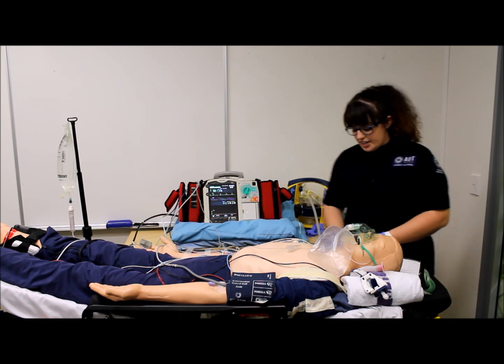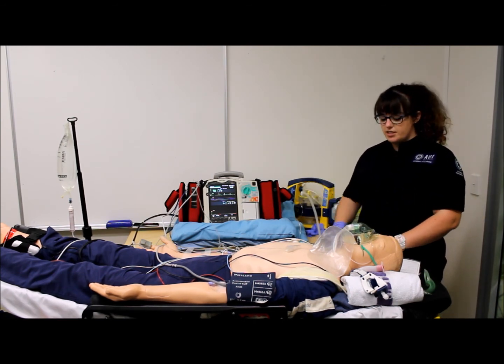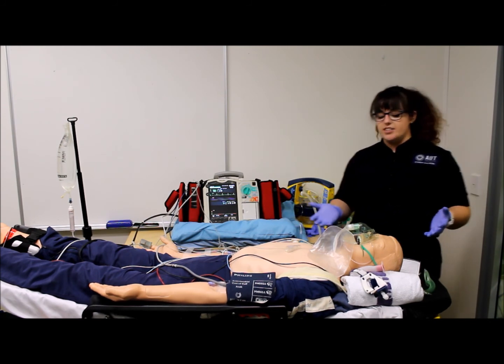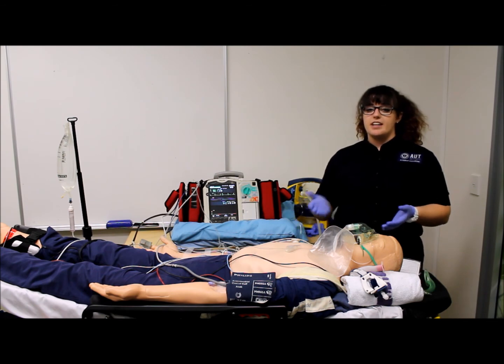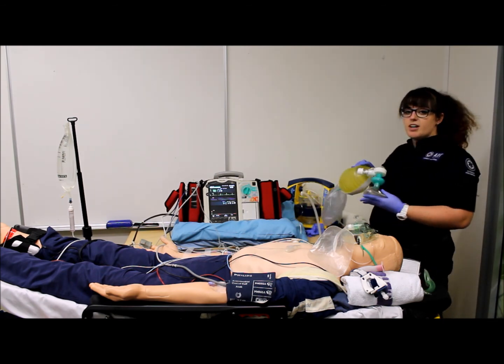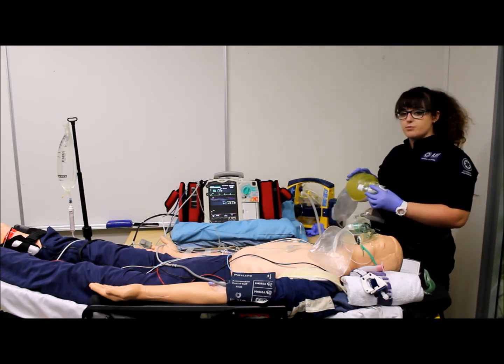We also currently have our suction unit ready, just in case our patient vomits, and so that we can prevent any aspiration of vomit into the lungs. Like I said before, we have our BVM set up behind me with our PEEP set to 5 centimetres of water.